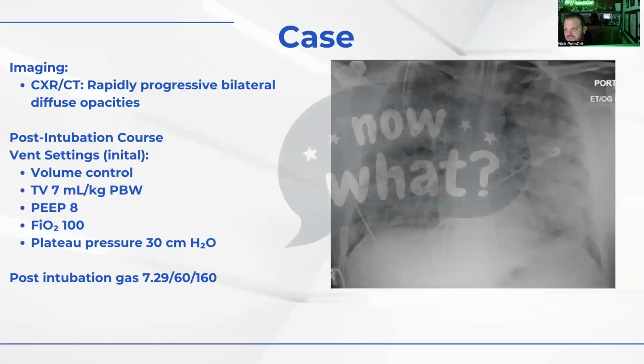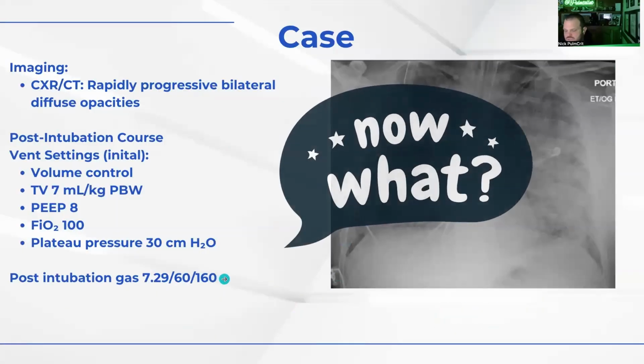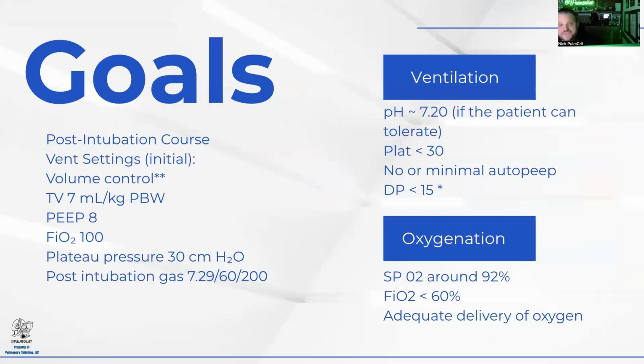And I think it was 160, 200. He's got ARDS. Okay, so let's not quibble over the details. He has ARDS. His plateau pressure is not in goal, which is a problem. His driving pressure is certainly not in goal, which is also a problem.